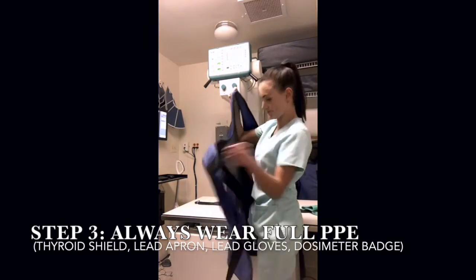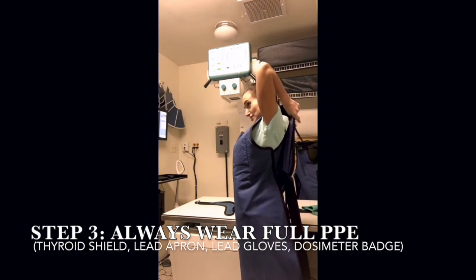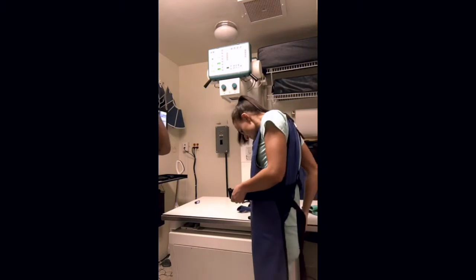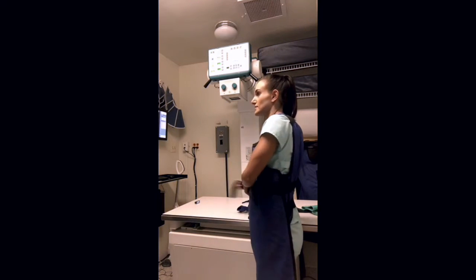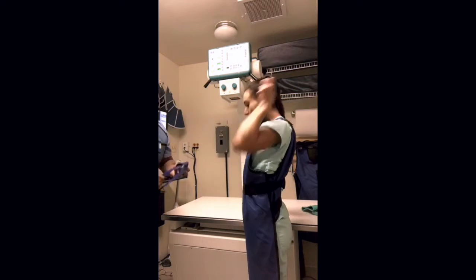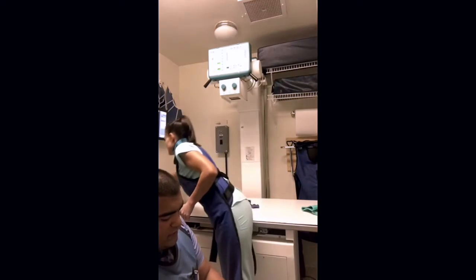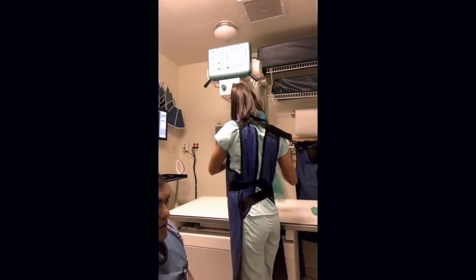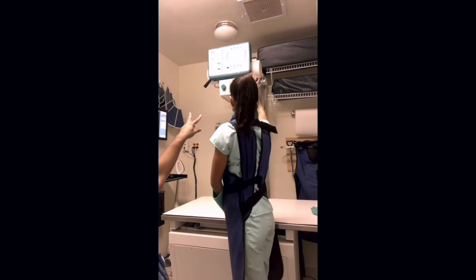It is extremely important to wear full PPE whenever taking an X-ray, just to ensure that you're really protecting your body against radiation and all its harmful effects. You should always be sure that that includes wearing your dosimeter badge, which actually measures the amount of radiation you are getting. It is also extremely important to not leave it in the X-ray room when you're not taking X-rays. If you do leave it in the X-ray room when you're not actually obtaining X-ray images, then your exposure levels will obviously be incorrect.